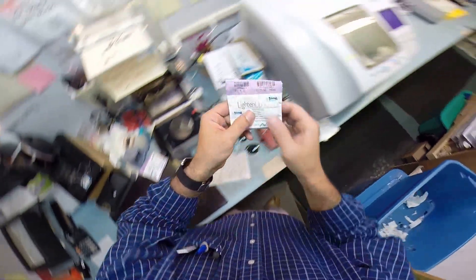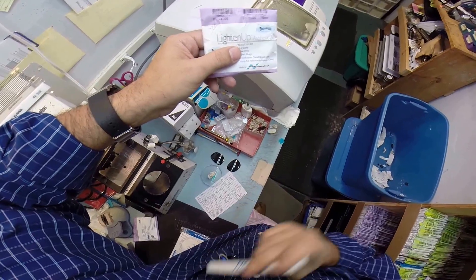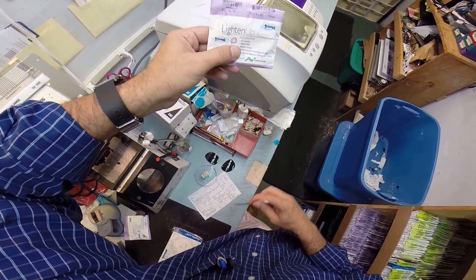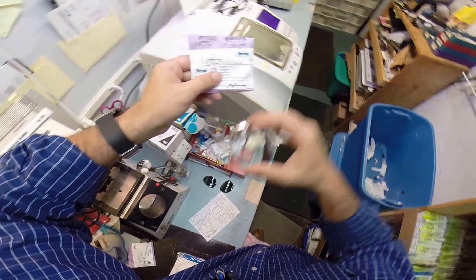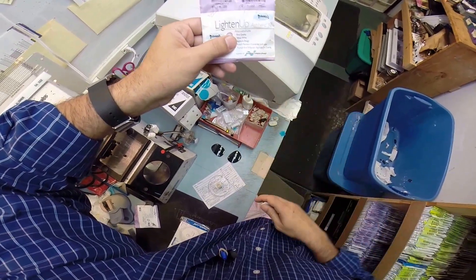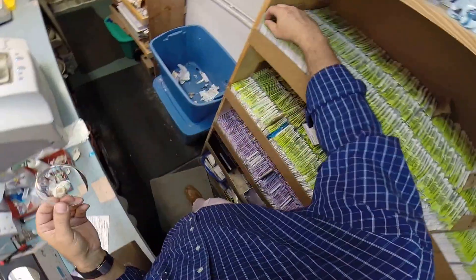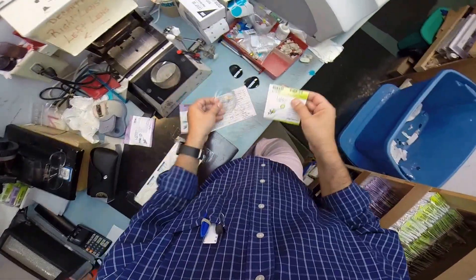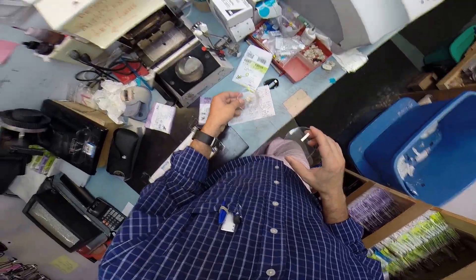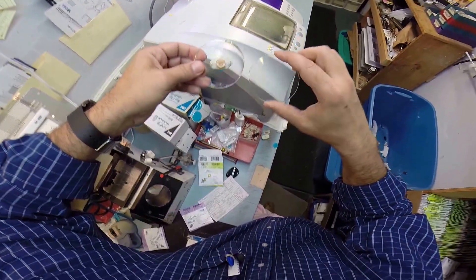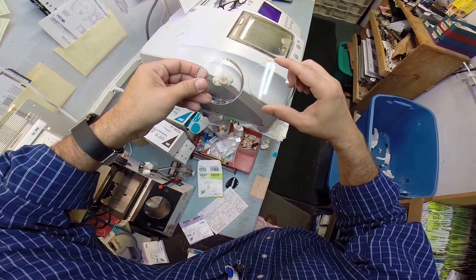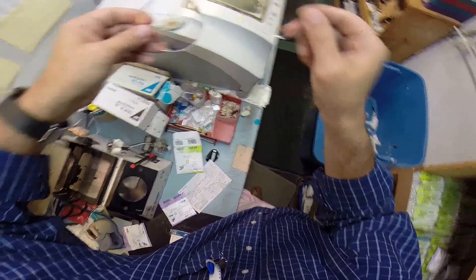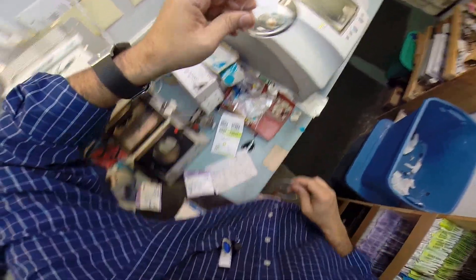So your lenses are polycarb. Polycarb is 40% thinner and lighter than regular plastic. It is virtually unbreakable. Your lenses are bulletproof up to 22 caliber and have both UVA and UVB protection automatically. It's also an aspheric lens, meaning it's a much flatter field of curvature, so it's going to fit inside and be a much better cosmetic appearance than the spherical lens, which can give you a fishbowl appearance. Your anti-glare coating is three features in one. It is an anti-glare, so it eliminates glare when driving at night, particularly driving at night in the rain, but from streetlights, stoplights, computer screens, overhead fluorescent lights, or any glare source. The second feature is it's an anti-reflective lens. So when someone's looking at you, they're not looking at their reflection in your lens. It makes for much better eye contact. Or if someone takes a picture with the flash, you don't see the flash lit up in the lens. The third feature that I like, it comes with the strongest scratch protection of any lens out there.